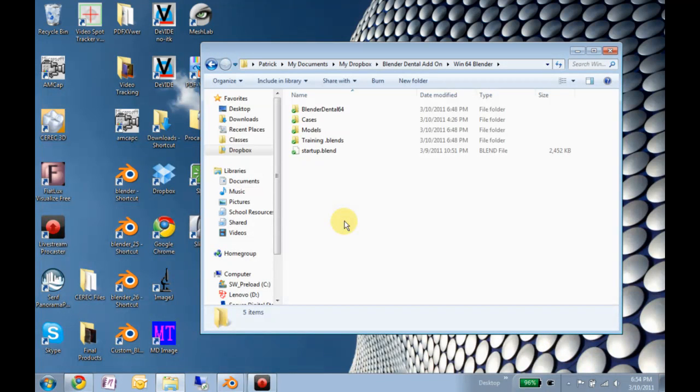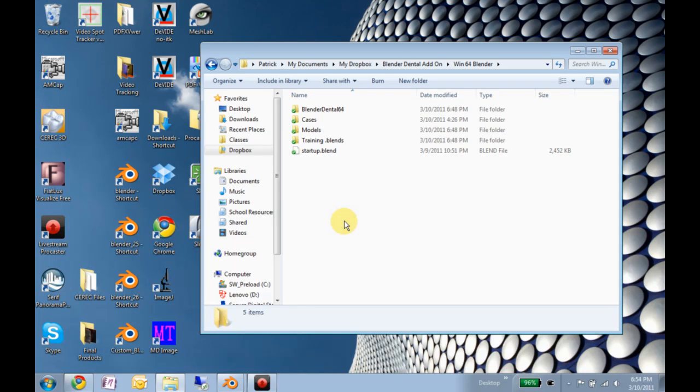Okay, I just want to make a quick video of how you get the Blender Dental add-on all set up.